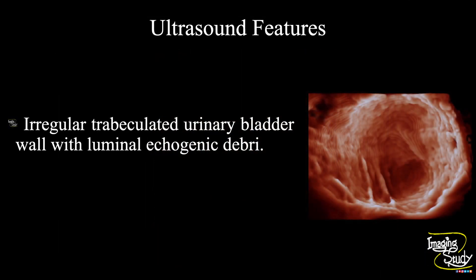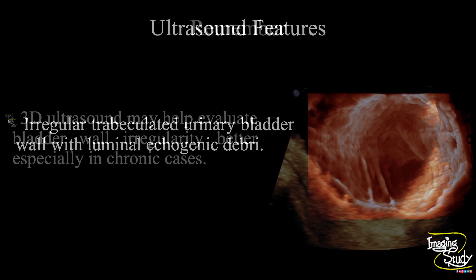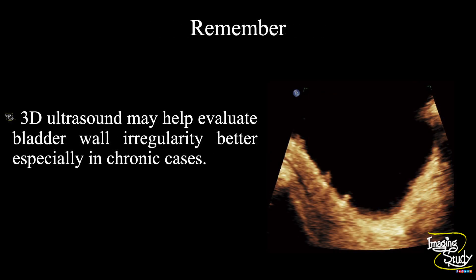In summary, an irregular trabeculated urinary bladder wall is seen with luminal echogenic debris, indicating a case of cystitis, more precisely chronic cystitis. The take-home message is that 3D ultrasound may help evaluate bladder wall irregularity better than B-mode ultrasound, especially in chronic cases.